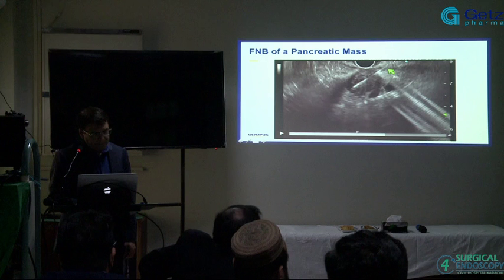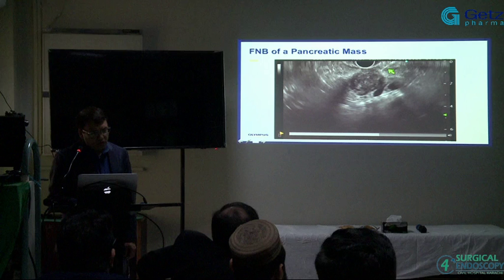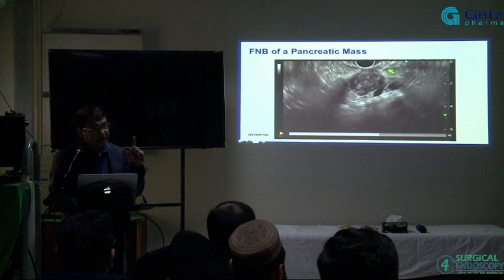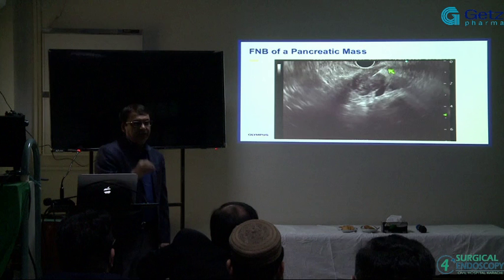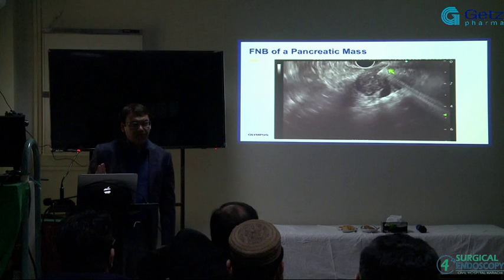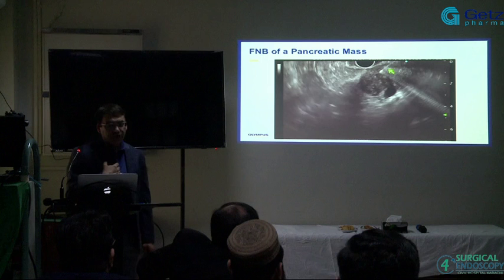And here, did you just take a look at that? With what speed and with what control the needle goes in? You see that? That's going to help you get through. That lesion does not move a millimeter, and the needle is in.